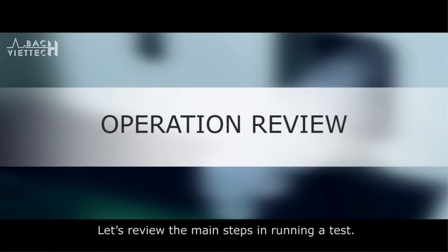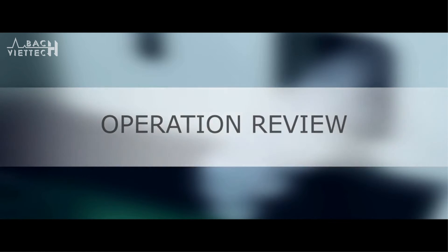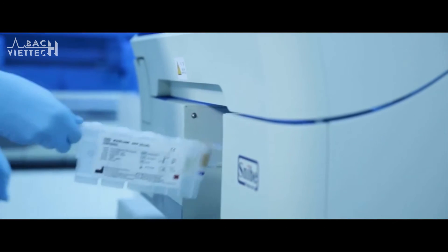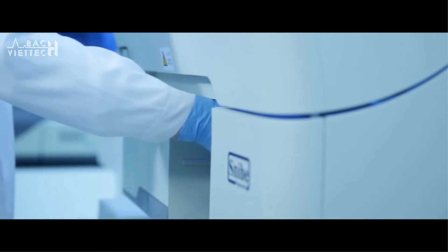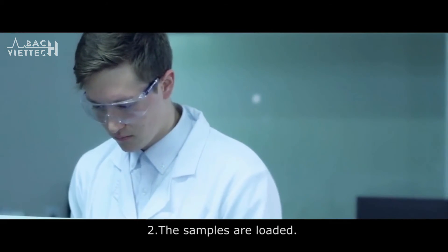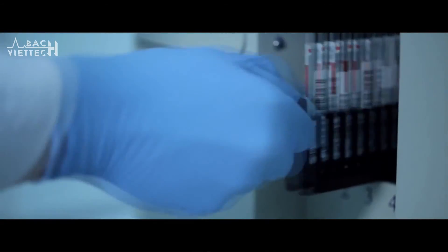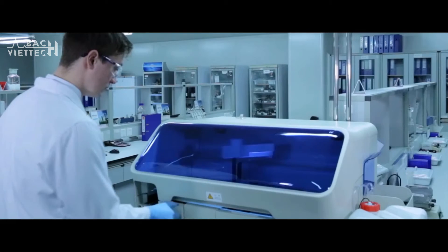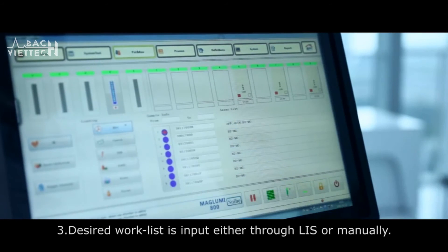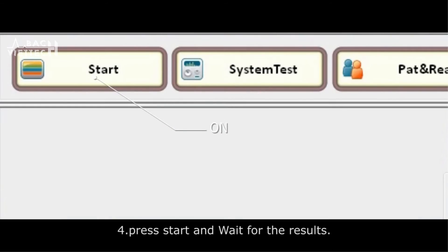Let's review the main steps in running a test. One: the user loads the desired reagents. Two: the samples are loaded. Three: the desired work list is input either through LIS or manually. Four: press Start and wait for the results.